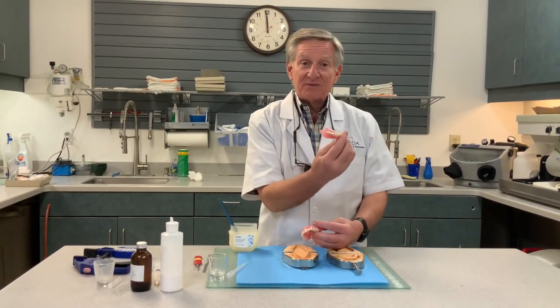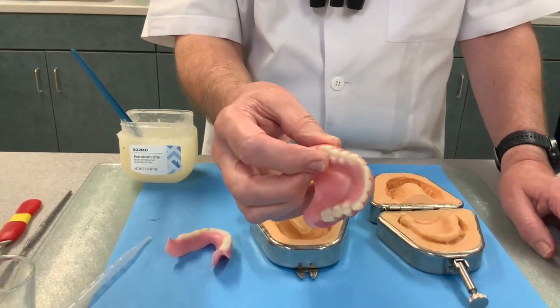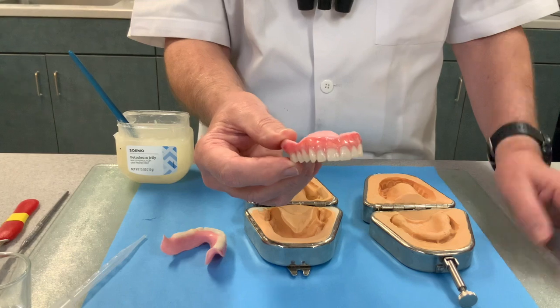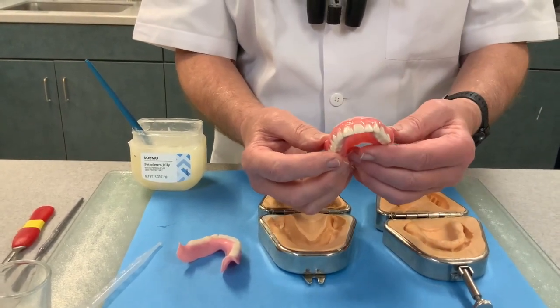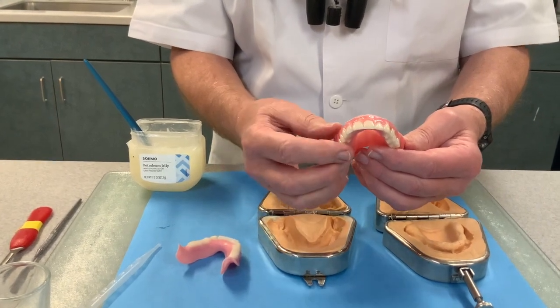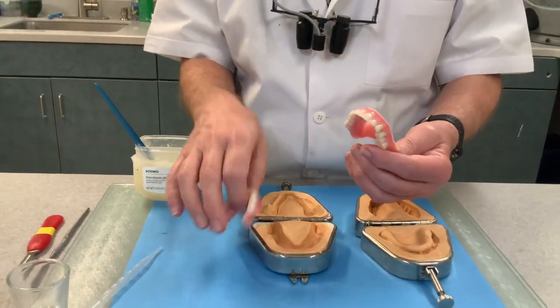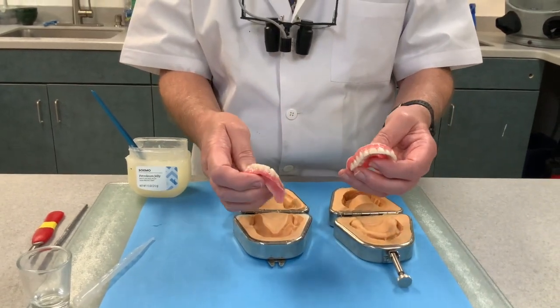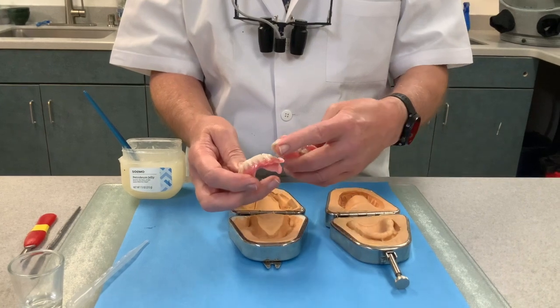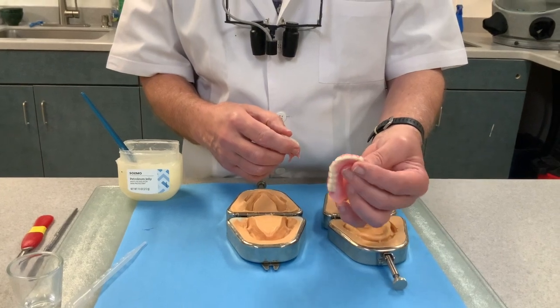You'll notice she still has bite blocks. He's actually custom characterized it, so it looks real pretty. You can do this two ways: you can make tooth-colored teeth with white acrylic, or you can order a second set of teeth and put the teeth into the jigs when you process it. This time these are just tooth-colored acrylic that he fabricated, then put the pink on, and used a characterization material to make it look pretty.